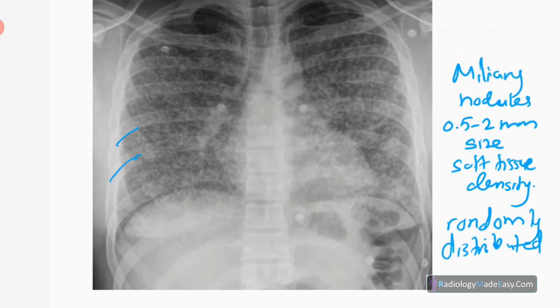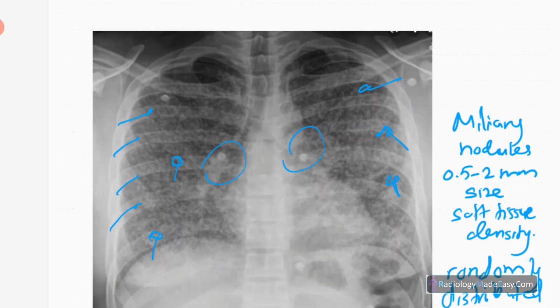Next is the sinister one with poor prognosis — miliary TB. There are randomly distributed soft tissue nodules, 0.5 to 2 mm in size. You can see multiple nodules in both lungs. There are no reticular opacities, no pleural effusions, no hilar lymphadenopathy, no fibrosis, no cavity formation, and no consolidation.